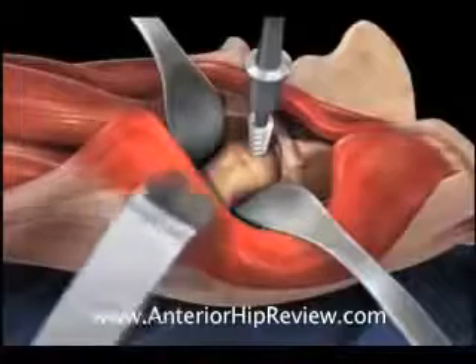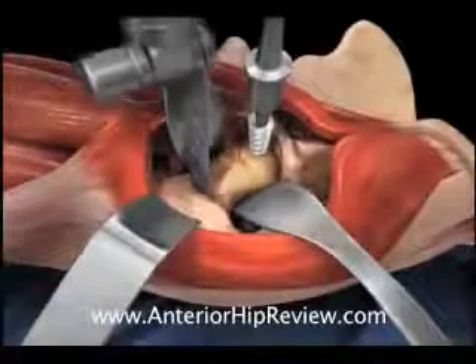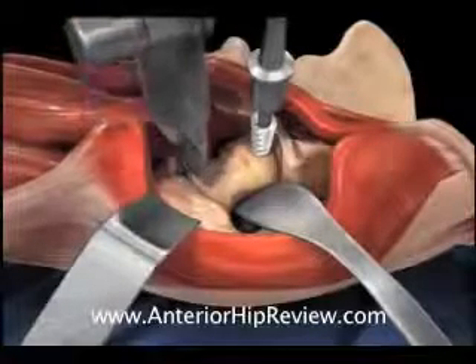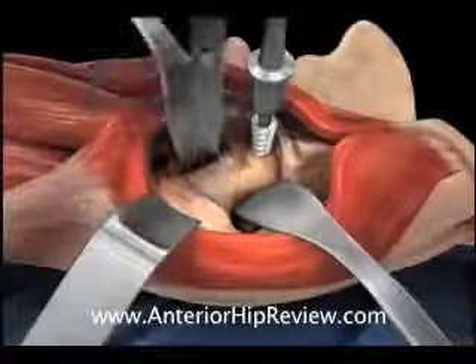Here is an illustration of the oscillating saw making the neck cut in the proximal portion of the femur. The power corkscrew in the femoral head is then used to lever the femoral head out of the acetabulum.